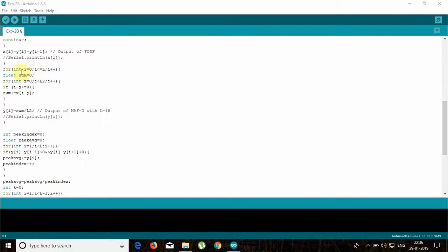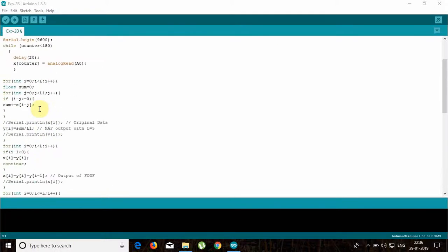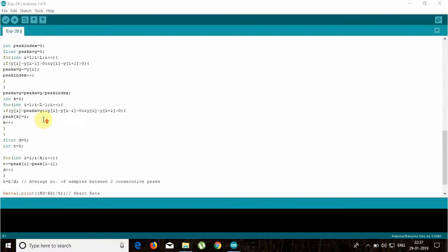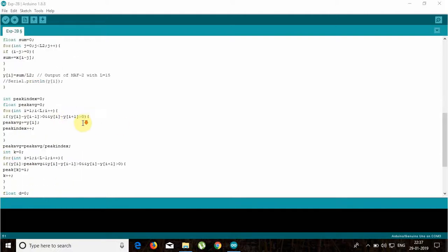Here the output of the first order derivative filter is used as an input to the second moving average filter. This second moving average filter further smoothens the data. So the order of the second moving average filter is 15, and we will calculate it similarly to the first order moving average filter. And then we can plot the output of the second moving average filter with this line.